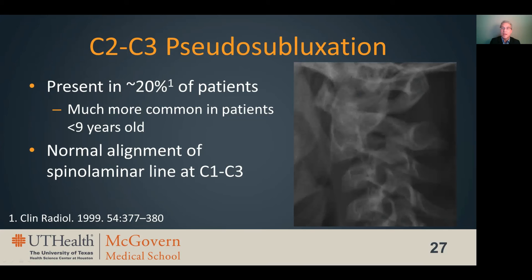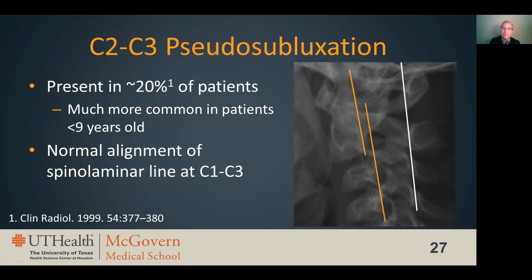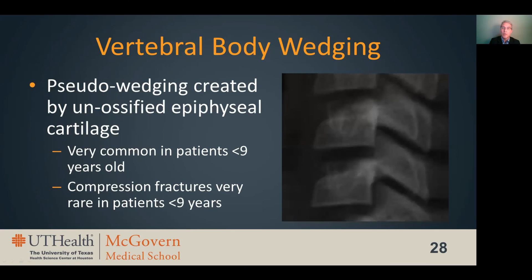C2-3 pseudosubluxation is a very common physiologic finding that can simulate cervical injury, particularly on radiographs. Children, particularly those less than nine years old, can present with anterolisthesis of the C2 vertebral body over C3, which can be confused with post-traumatic subluxation. Pseudosubluxation can be differentiated from true subluxation by recognizing that while there is offset of the C2-3 vertebral bodies, the spinal laminar line remains in normal alignment at the C1 through C3 levels. Physiologic wedging is another very common phenomenon in the subaxial spine particularly in patients under the age of nine, and vertebral body compression fractures are extremely rare in patients younger than nine.